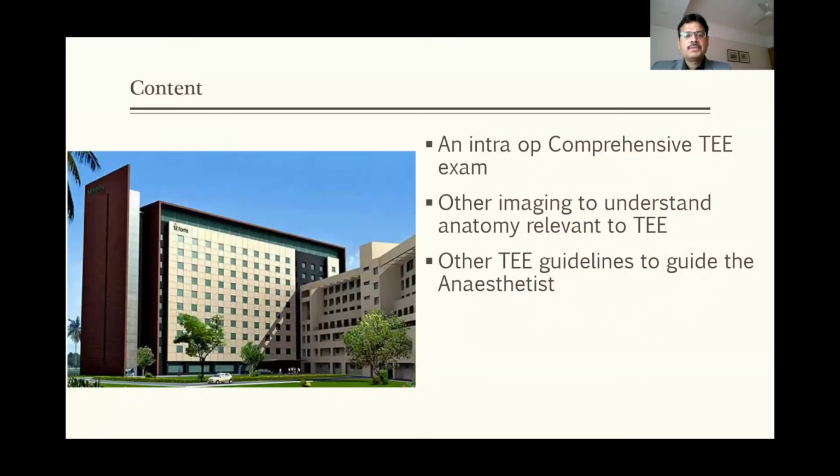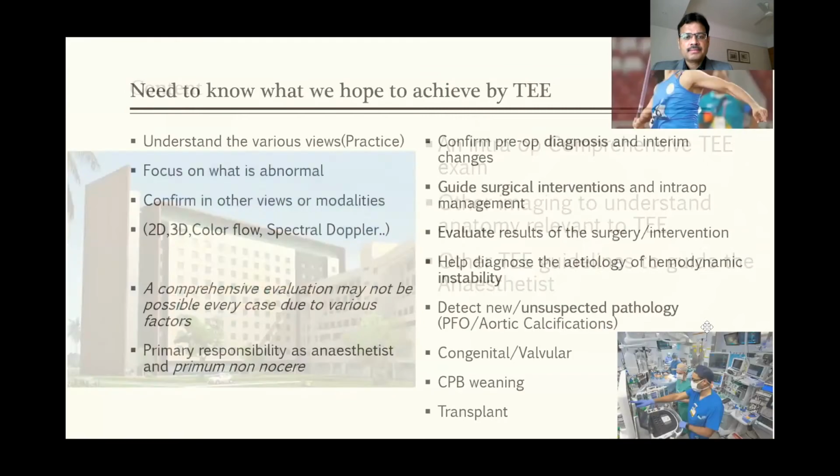I bring you compliments from my hospital, Fortis Hospital, Mulund, Mumbai, and I'm just going to talk on intraoperative TE, the comprehensive TE exam, with some tips for youngsters who have just been initiated into TE. I just want to give them an idea about how they could use other radiological means for understanding the anatomy relevant to TE, and speak briefly about the other TE guidelines to guide the anesthetist.